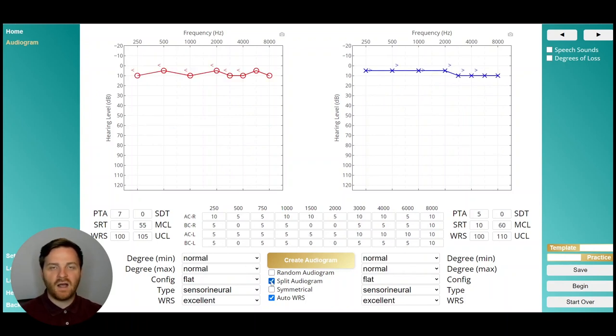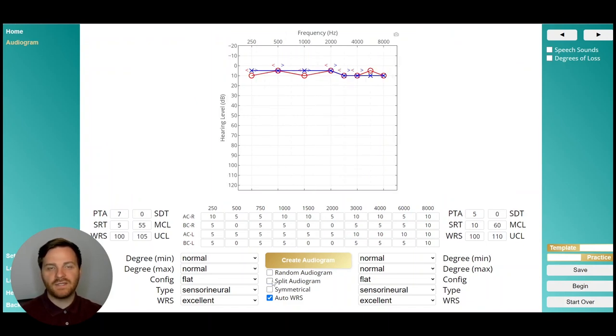The next setting down here is split audiogram. Sometimes it's easier to see the audiogram, especially with asymmetries and masking, if you overlay the two ears on top of each other. If you uncheck split audiogram, it will do exactly that.